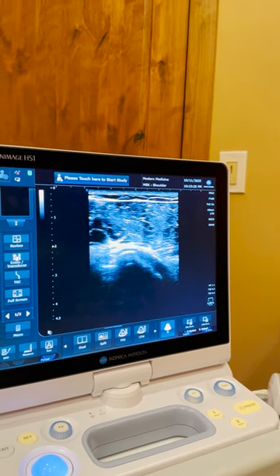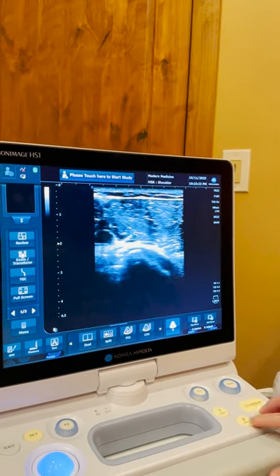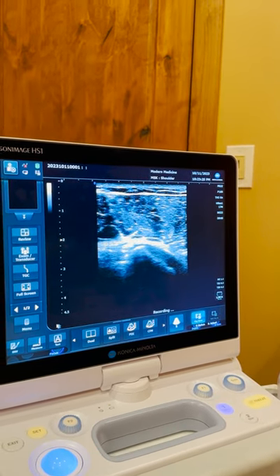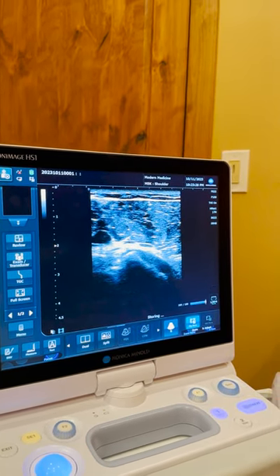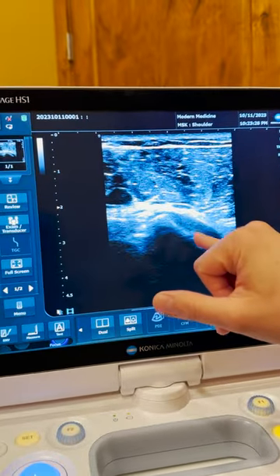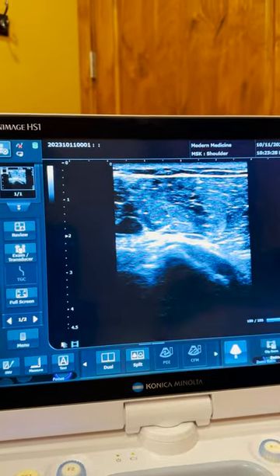Hold that position so I can take a picture. We can take pictures and go back for further evaluation, freeze it, take the probe off, and make annotations on the screen. I can show the patient exactly what we found — this is what a tear looks like, whatever the case might be.